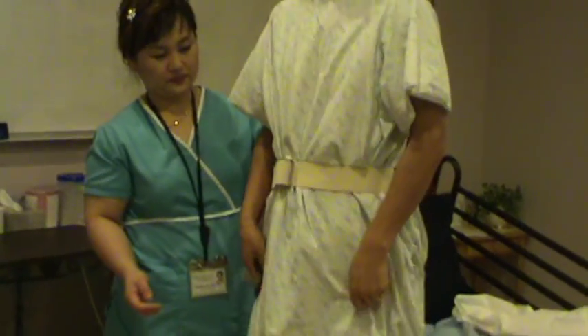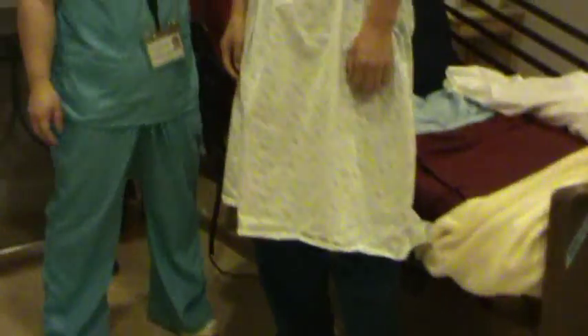I'm going to count one, two, three. On three, you're going to stand up. Can you do that? Ready? One, two, three — stand up. Good. You're very tall! Now, can we walk to the bedside scale? Make sure he's covered from the bed.